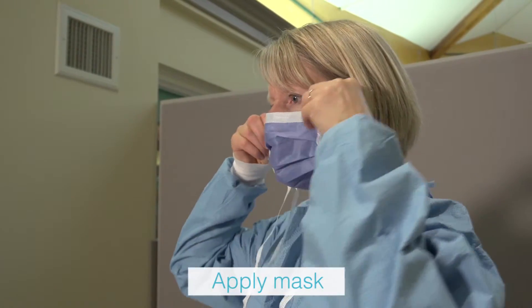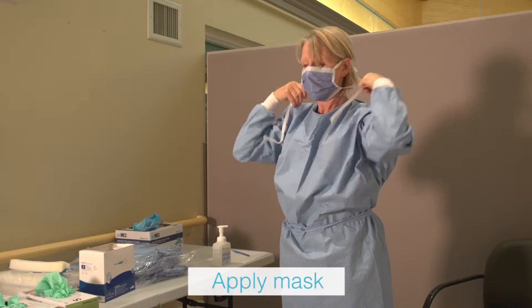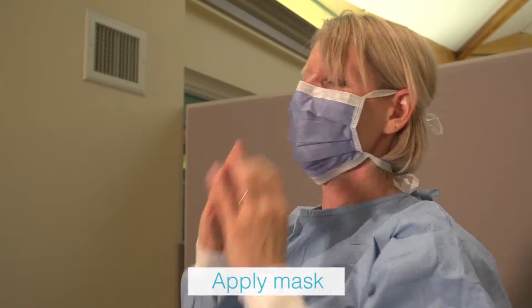Place mask over nose, mouth and chin. Secure ties at the crown of the head and base of the neck. Adjust flexible nose piece over the bridge of nose using both hands.